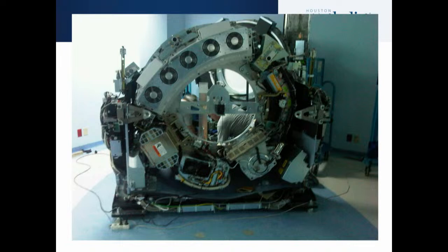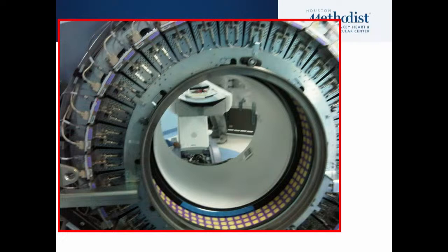So if I zoom on this, now you see these different rows that you see here. Let me see if I can move the mouse. Yeah. So these are different rows of detectors. So these are the detectors. Compared to SPECT, where the SPECT head is rotating around the patient, now we have a full circle, a full ring of detectors around the patient that is in there.